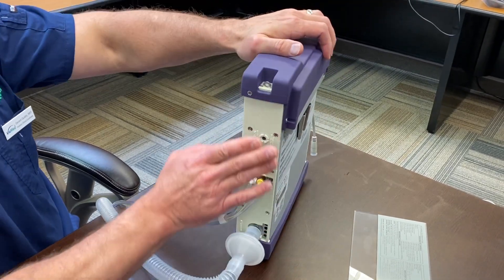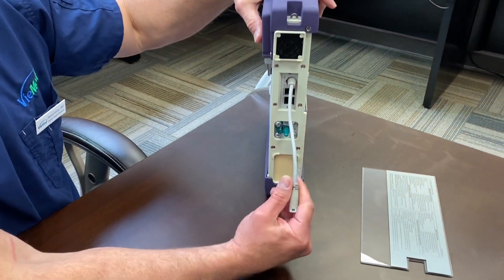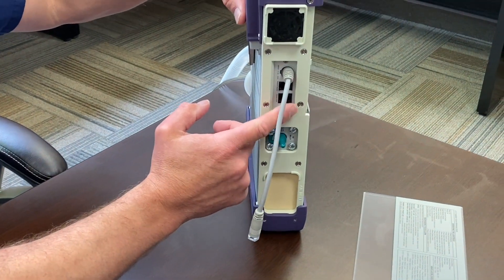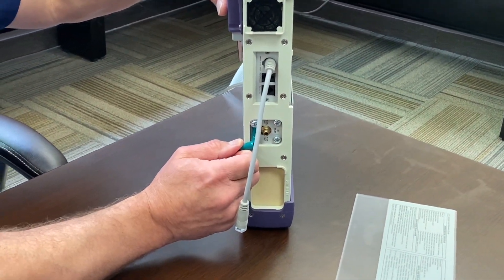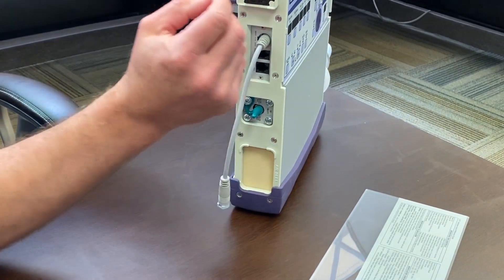This right here is your audible alarm speaker. On the opposite side, you're going to have your main power supply cord, and you'll have some additional plugs for external alarms and a nurse's call button. This port here is to bleed in additional oxygen.